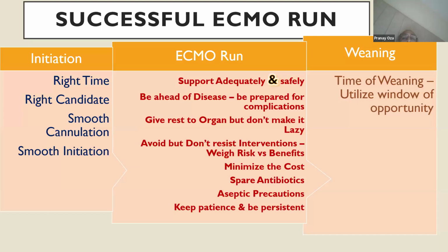So to run a successful ECMO, you require the right team, right time, right candidate, smooth cannulation, and smooth initiation. At the time of initiation, ECMO runs should be done with the support adequately and safely. This is the most important word. It's not adequately or safely. It's going to be adequately and safely.